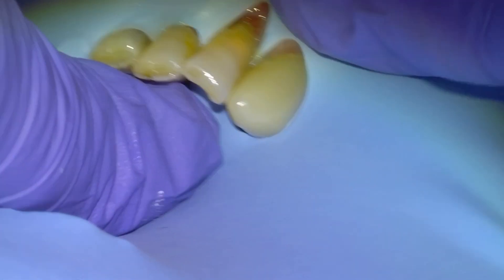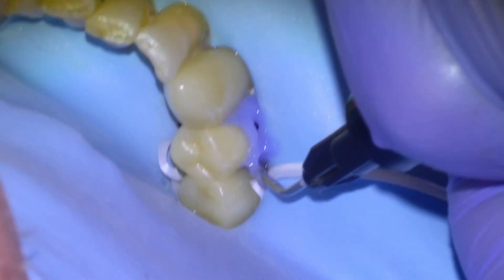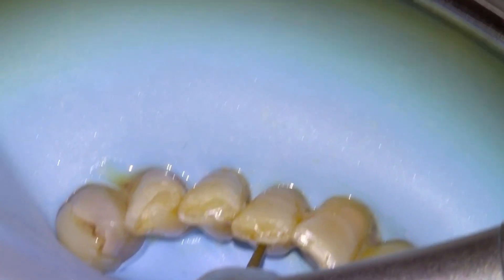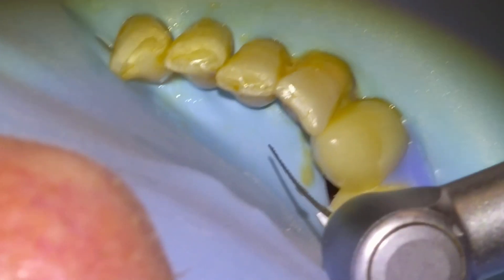Then we'll put a rubber dam on to isolate the tooth, take it a little bit farther back so that we can get our instruments in easier. Use a little bit of liquid dam for the voids and then start opening up the coronal third of the root canal with an SX shaping file, irrigating with full strength hypochlorite.